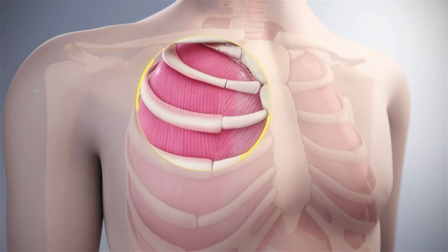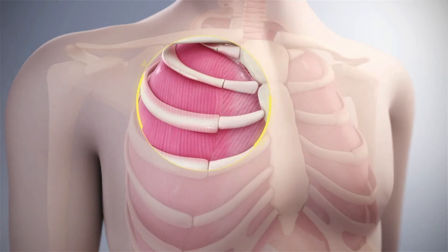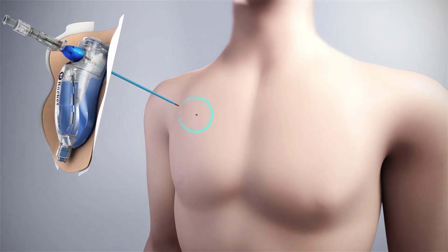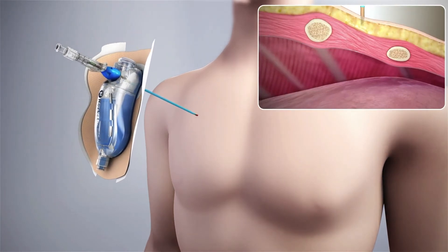The recommended insertion site for the Rocket Plural Vent is the second intercostal space at the mid-clavicular line. Prepare and anaesthetise the insertion site. Insert the catheter through a 5 mm skin incision over the superior border of the rib into the pleural space.